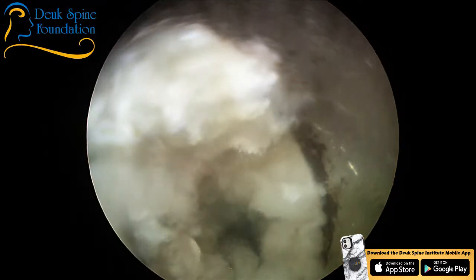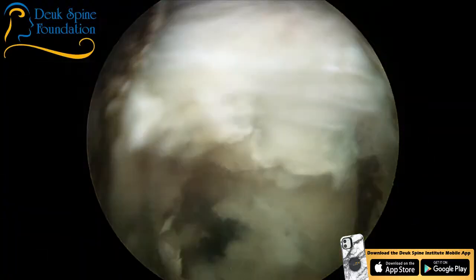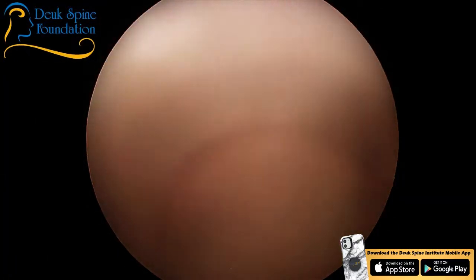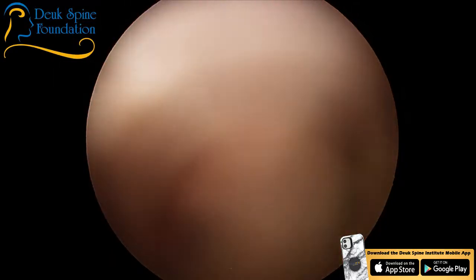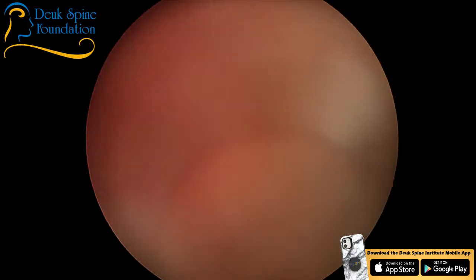I hope to God that's not the lens. And that needs to go as well. That's the tear. So I'm creating a back pressure situation by filling my endoscopic tube with the grabber, with the pituitary rongeur. And that creates back pressure. And that back pressure fights against the bleeding coming out of the vein.